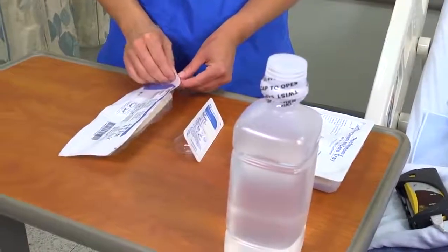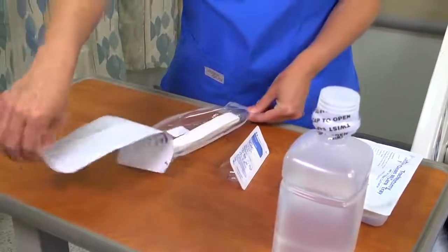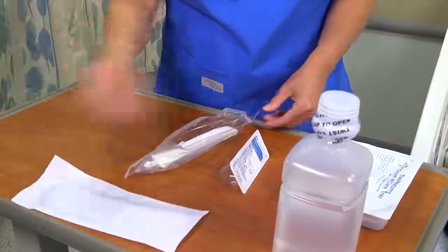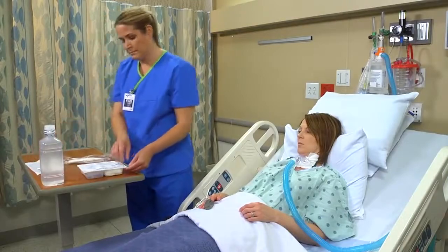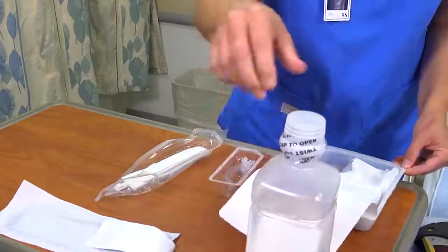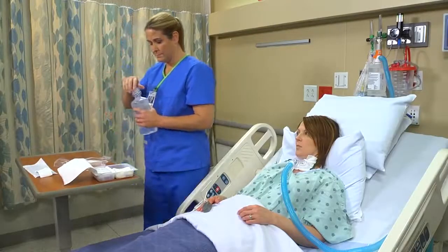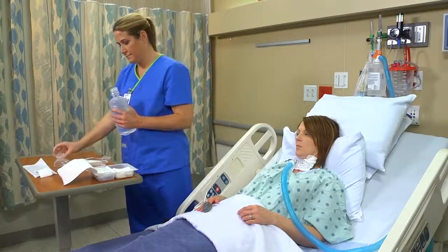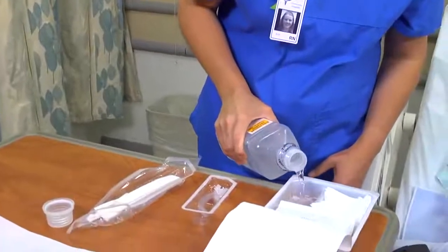Open the package for the tracheostomy tube holder according to the manufacturer's instructions. If your patient has a disposable inner cannula, open that package now. Then open a tracheostomy care kit, which contains 4x4 gauze, cotton-tipped applicators, dressing, cleansing brush, drape, and a suction catheter. Pour half an inch to an inch of normal saline solution into the sterile basin.